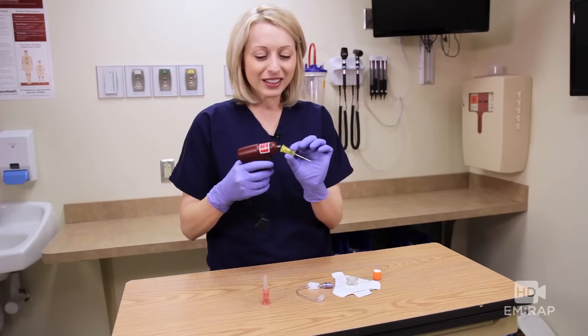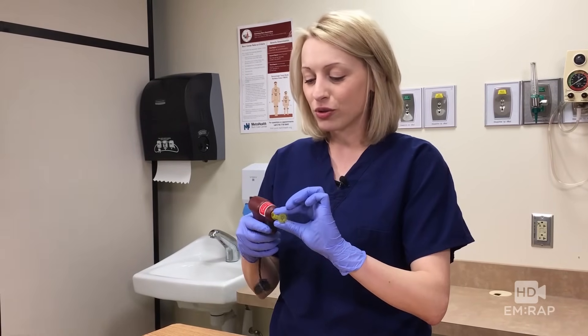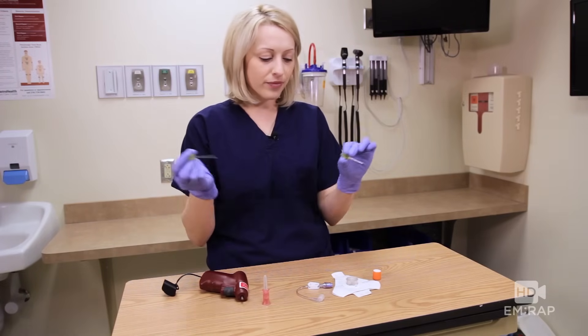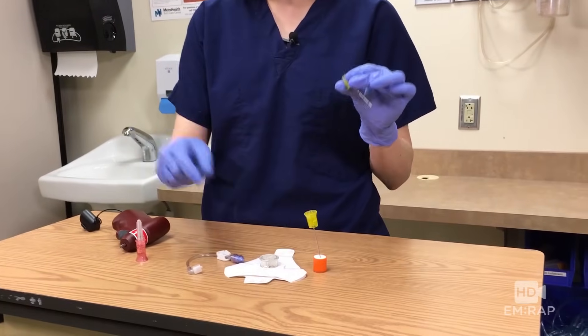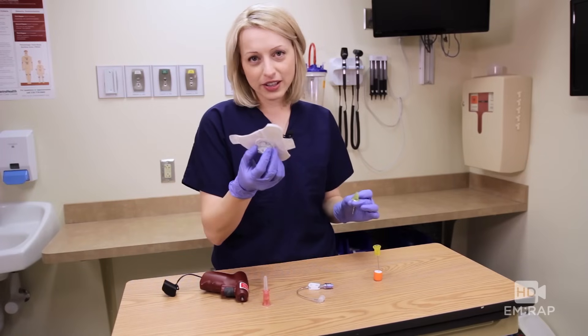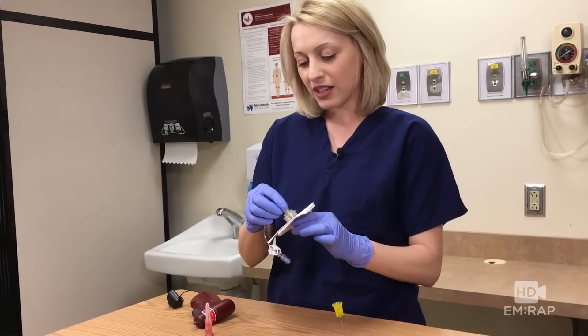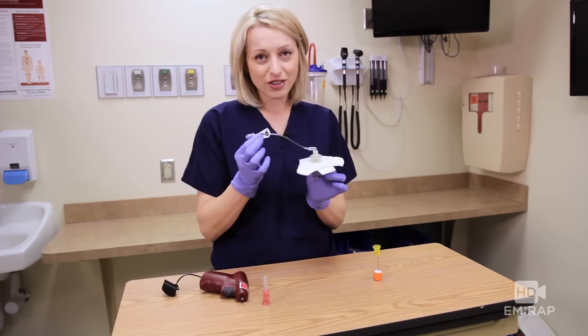It attaches magnetically to the drill, and then once it's drilled into place, you're going to remove that stylet. Safety first. And then this proprietary dressing fits nicely over the top right there, and you can then connect your tubing and you're all ready to go.